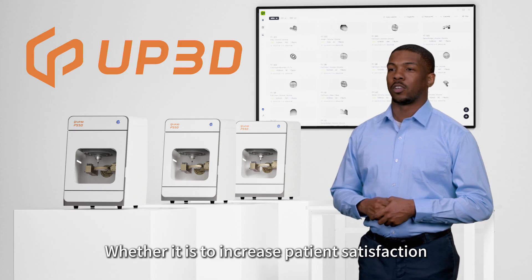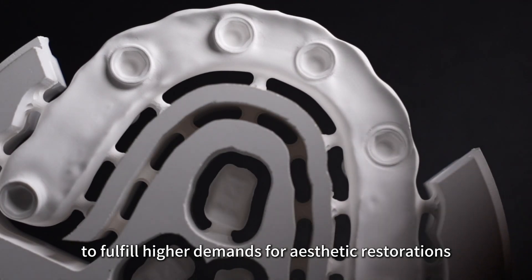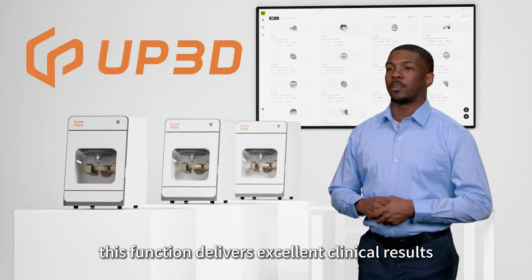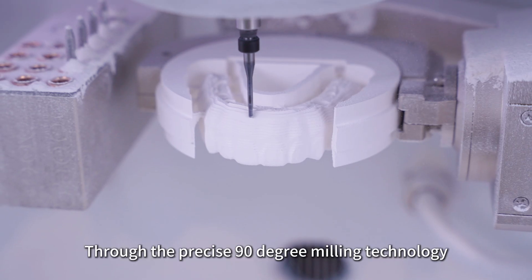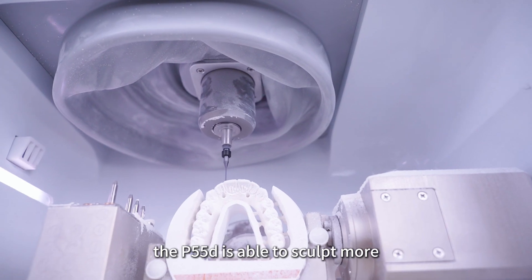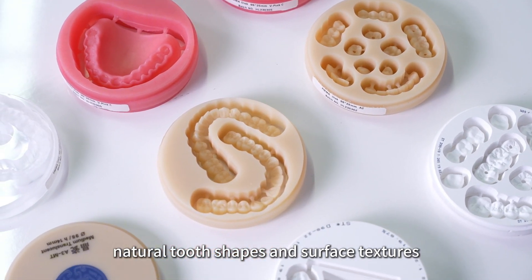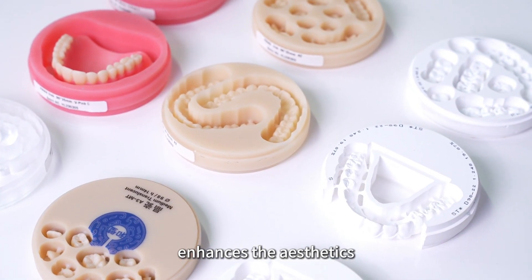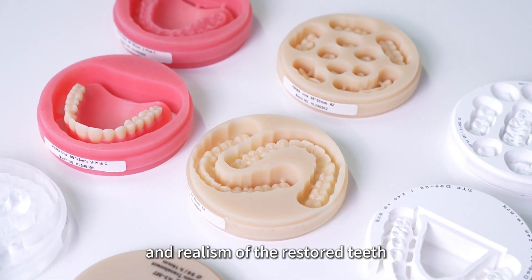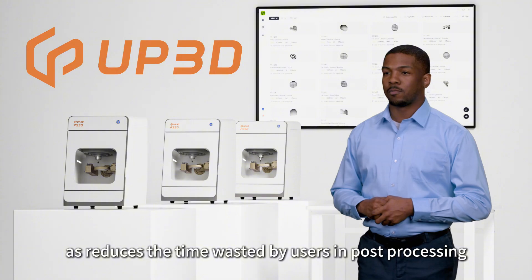Whether it is to increase patient satisfaction or to fulfill higher demands for aesthetic restorations, this function delivers excellent clinical results. Through the precise 90-degree milling technology, the P55D is able to sculpt more natural tooth shapes and surface textures, which greatly enhances the aesthetics and realism of the restored teeth, as well as reduces the time wasted by users in post-processing.